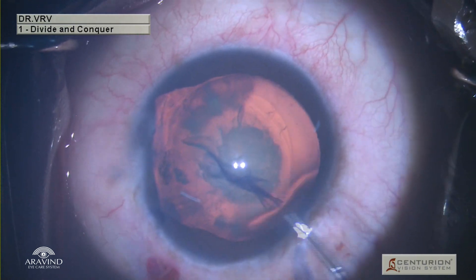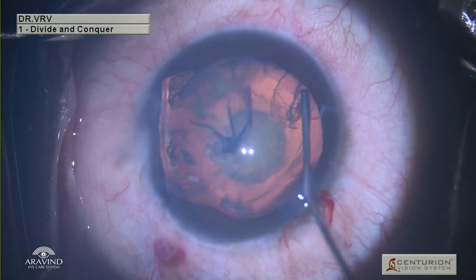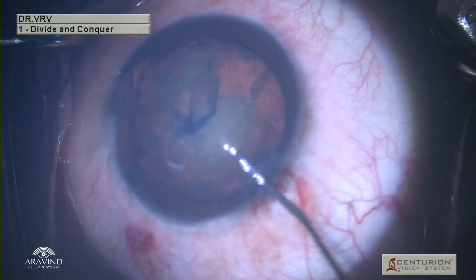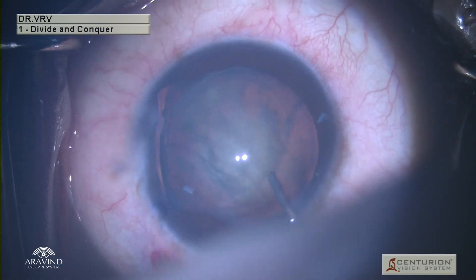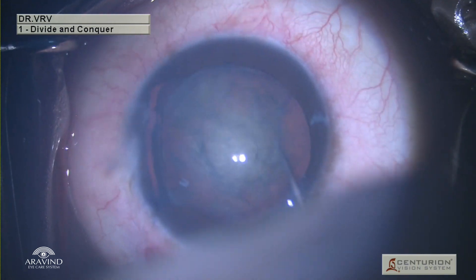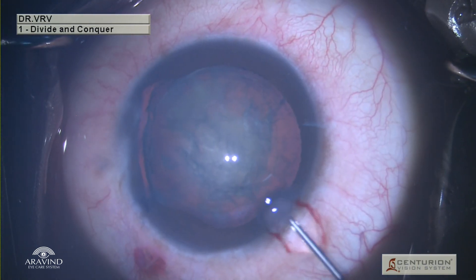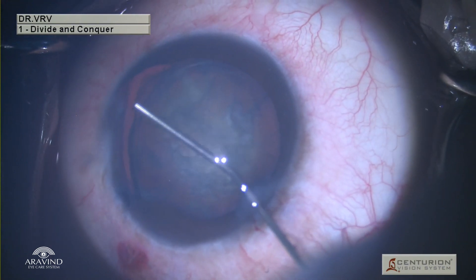Once the rhexis is complete, viscoelastic is removed from the anterior chamber by gently flushing BSS into it, and using a hydrocannula, gentle hydrodissection and delineation is done. Make sure the nucleus does not collapse into the anterior chamber. Once hydrodissection and delineation is completed, viscoelastics must be injected at the site of zonular dehiscence in order to prevent vitreous from coming into the anterior chamber.